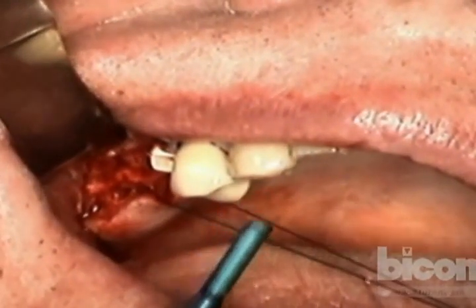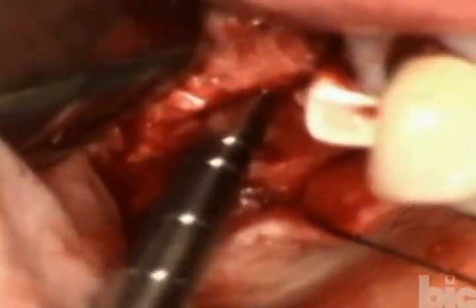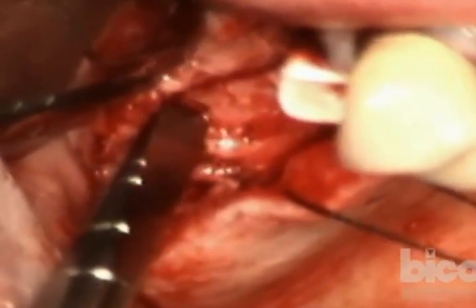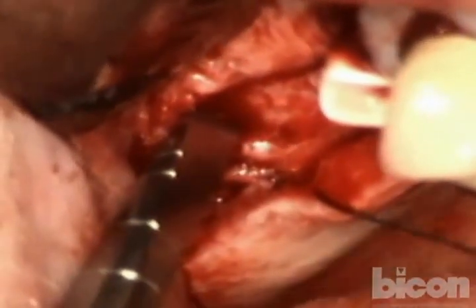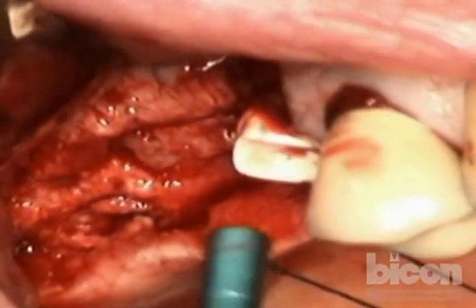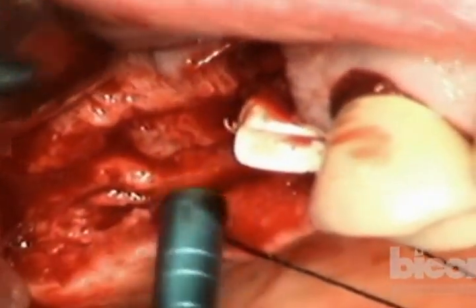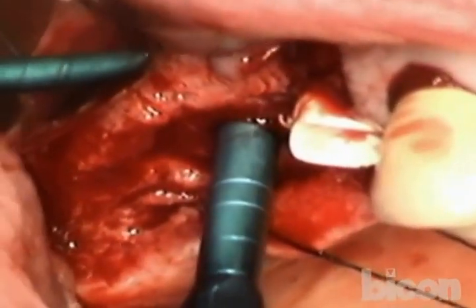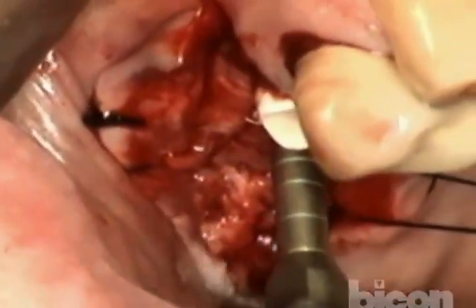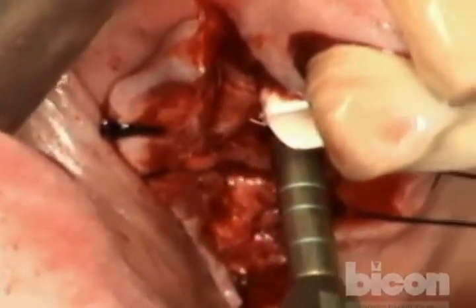Okay, so it's kind of flat. It just pushes against it. I want to score it some more. I'm using a smaller osteotome now because I want to go slightly deeper but not too deep and selectively cut where I need to go, okay? I can feel it starting to move, but it takes a lot of work and a lot of patience. Okay, I switched to a smaller sinus floor osteotome. And these actually come in the Bicon kit.